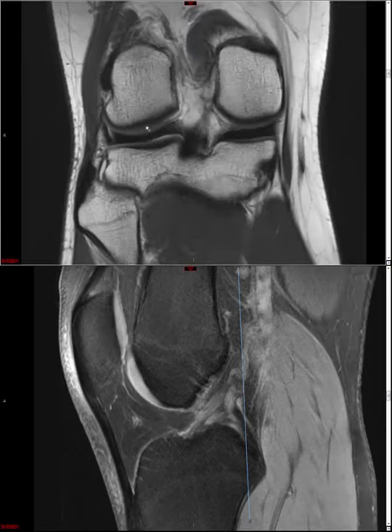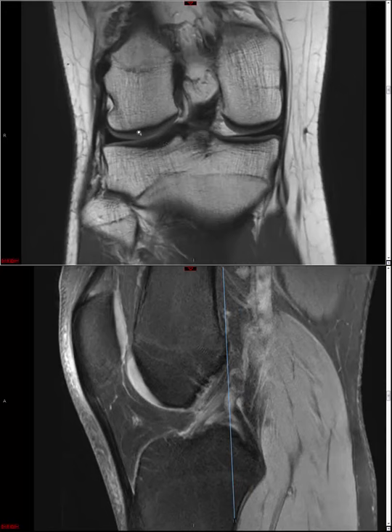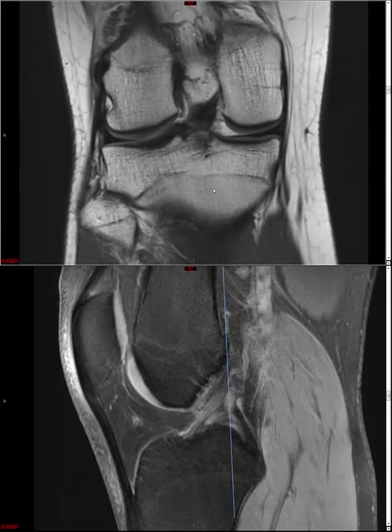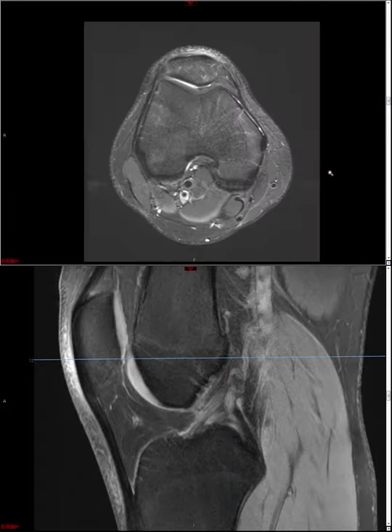So once again, if you feel like all the cartilage is gone, you're down to the black here, but you don't see secondary changes in the bone, then you may still be seeing some intact overlying cartilage. So I would still call that just moderate. But if you do see secondary changes, so marrow edema or cyst formation, then that's pretty good evidence that joint fluid has gone through this full thickness cartilage defect and is now insinuating into bone. And I'm happy calling that full thickness cartilage denuding or severe chondrosis or grade 4 chondrosis, however you like.